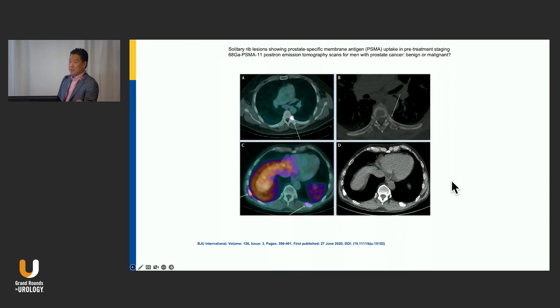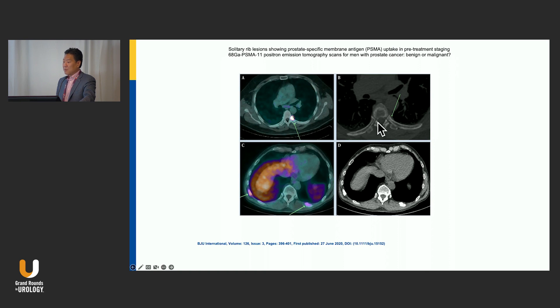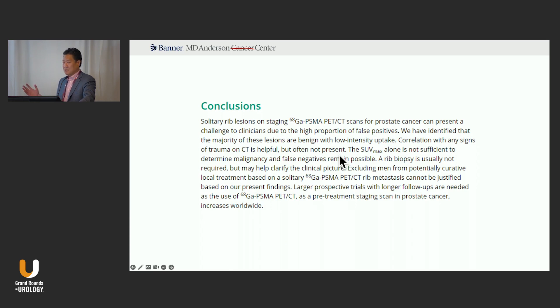Solitary rib lesions is probably one of the biggest pitfalls right now with PSMA PET. Once the radiologist starts reading it, they see a little bit of activity in one of the ribs and often either they'll call it a met or they'll hedge. If you see a solitary focus of uptake in the rib and on CT it clearly looks like a metastatic lesion — it's blastic, expansile — yeah, it's probably a met. That said, 99% of those cases are usually just a little bit of uptake in the rib with nothing on CT, and in those cases it's not a metastatic lesion.